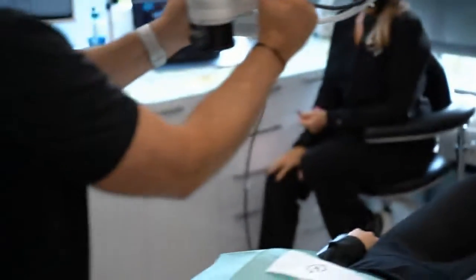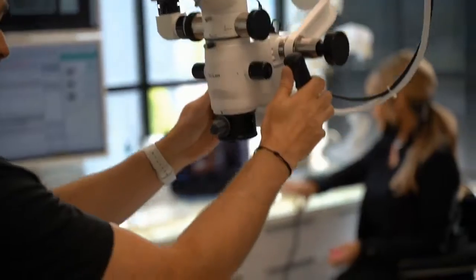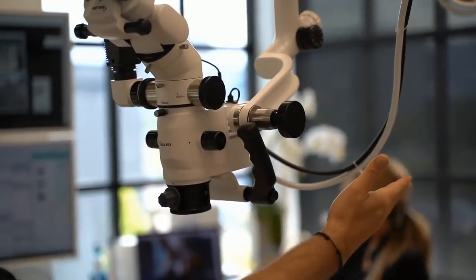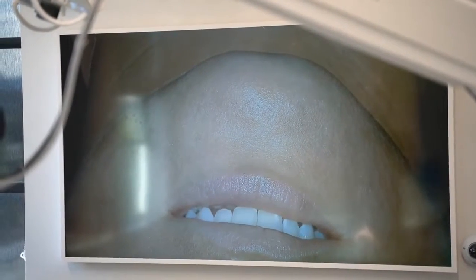So for instance, as a talking point, I have this spot. This is not practical to keep in focus like so. But what if I'm wanting to talk about something and show this camera, show my screen? This is kind of out of focus, but I have a lot more depth of field here than I do here.